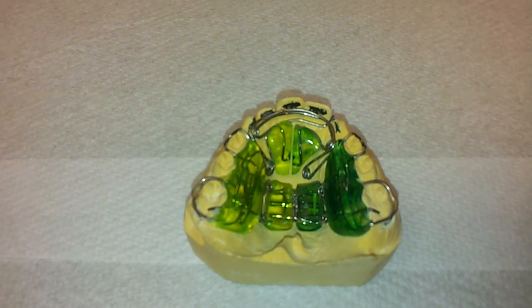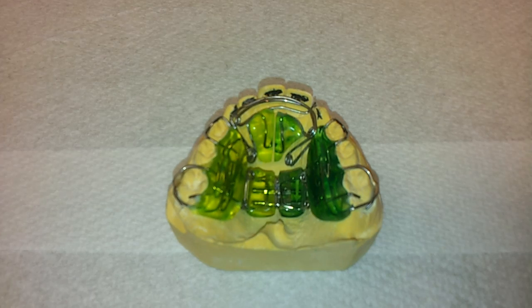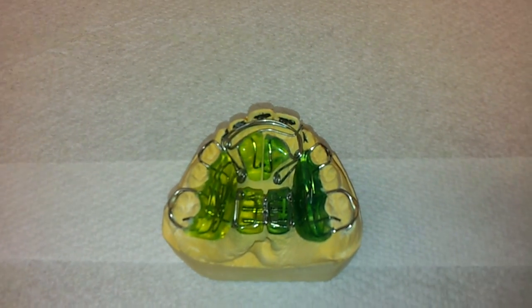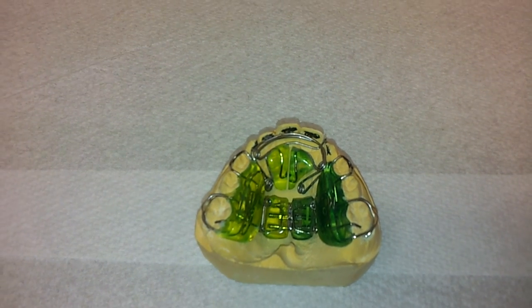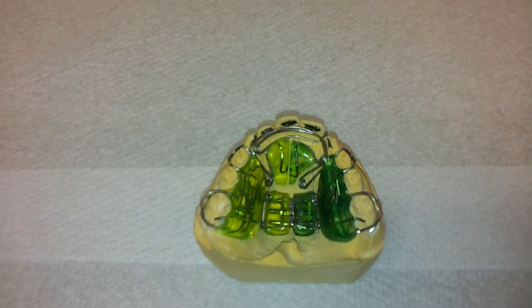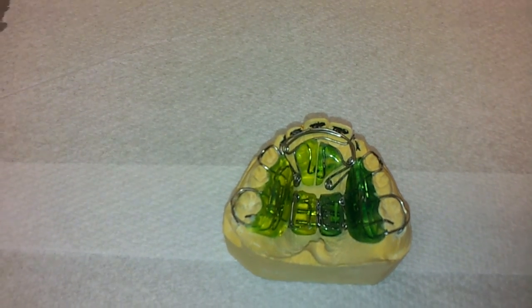The appliance, which I'll show you in a minute, is able to be distorted so that you can actually change what is essentially, in this case, a tapered arch and give more fullness to the arch — more rounding and much more development in the pre-maxilla area of the fours and fives.